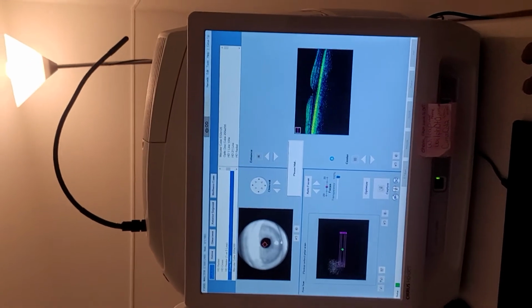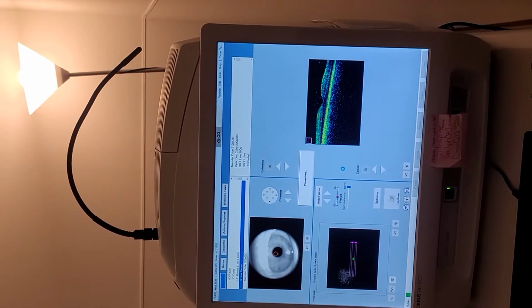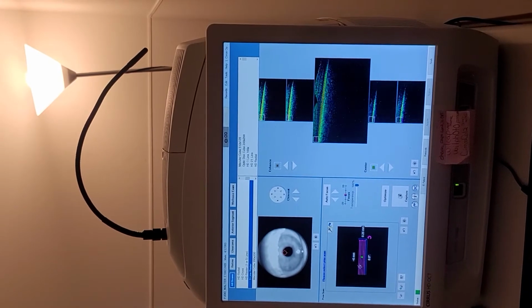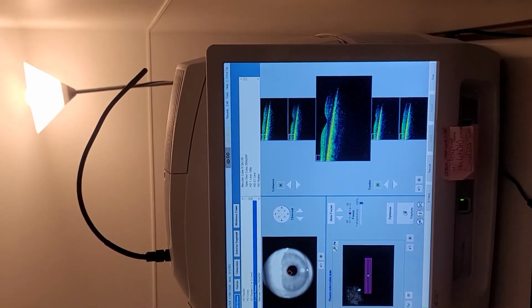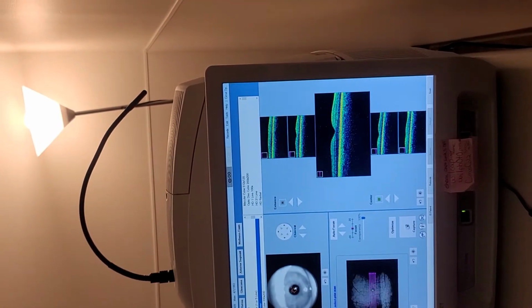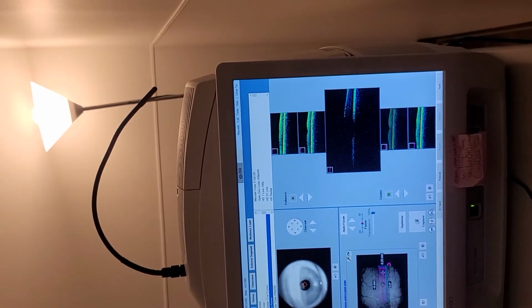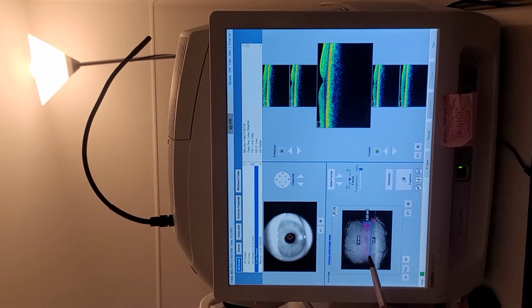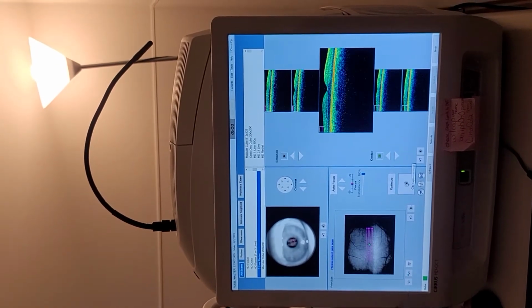I think those are the things, when you're first learning how to do it, that people don't teach you or tell you because they simply forget or they don't do it themselves. Optimize. Okay, now that's pretty good, right? Because our image over here is good. Capture.